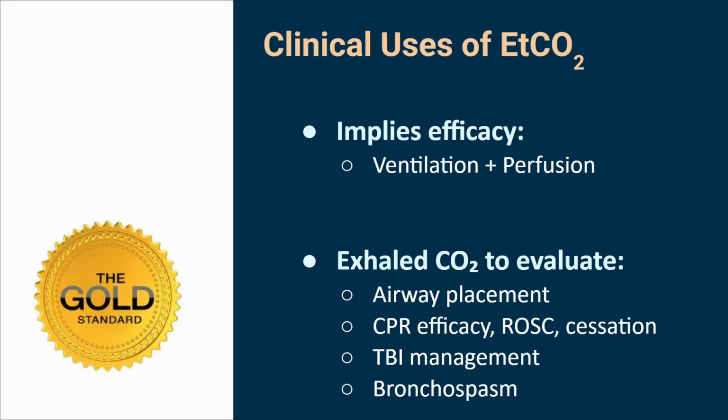Not a lot to say, you put them in the sniffing position, and then you push it through their nasopharynx, essentially all the way down there. Sometimes you have to twist it to get past the glottis, and as soon as it fills with condensation, you know you're basically in the right spot.